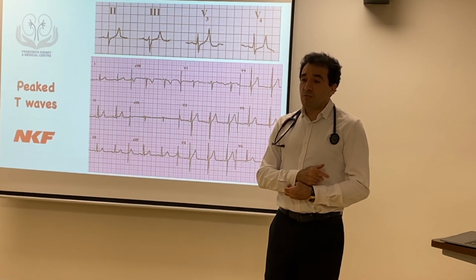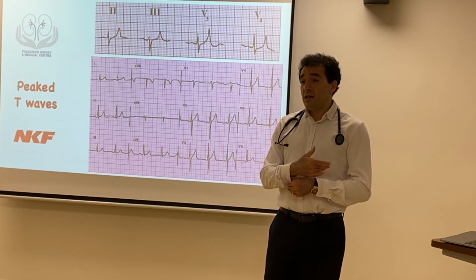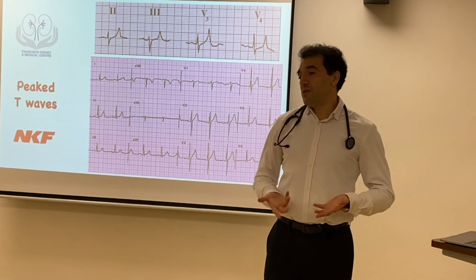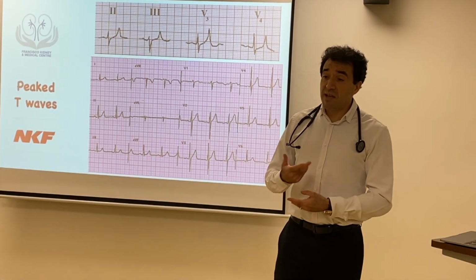If it's something new, then you probably need to flag it, investigate and treat. Eventually, you still need to accept the patient and dialyze, and then probably you will need to continue with dialysis despite having that. There are many patients that have these problems, but simply they are higher risk.